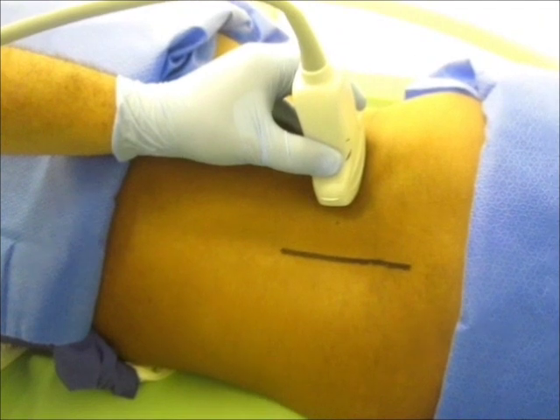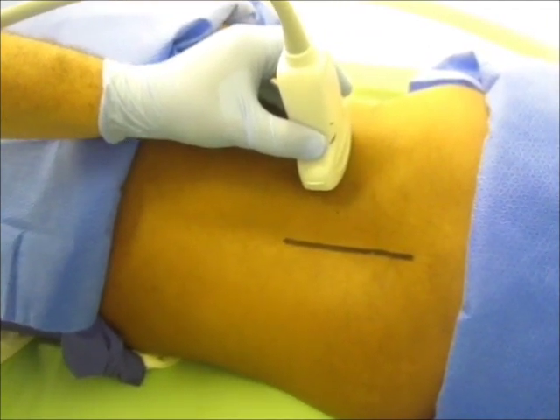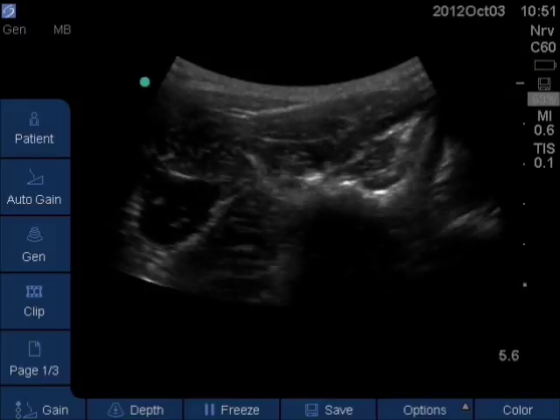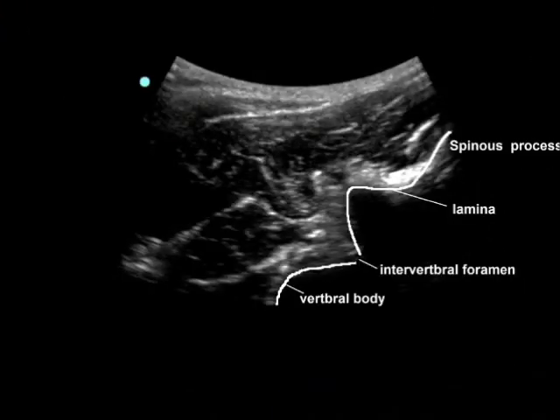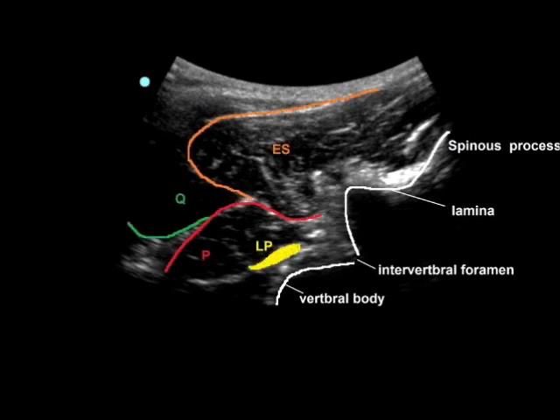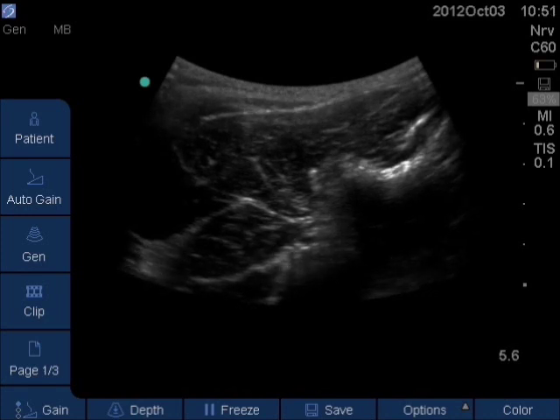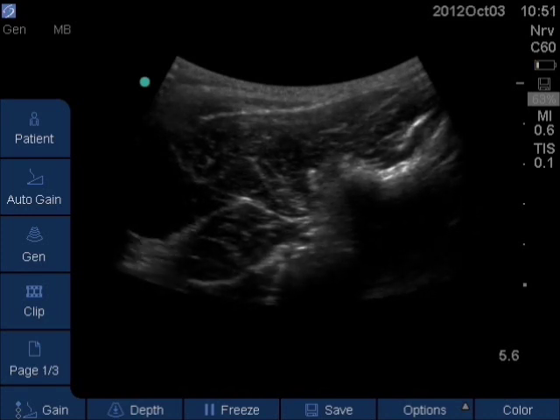Once the transverse process is identified, move the ultrasound probe in the cephalic direction to identify the wave sign. In this plane, the lumbar plexus can be identified just lateral to the body of the vertebra. Note the pulsating vascular structures beside the lumbar plexus.